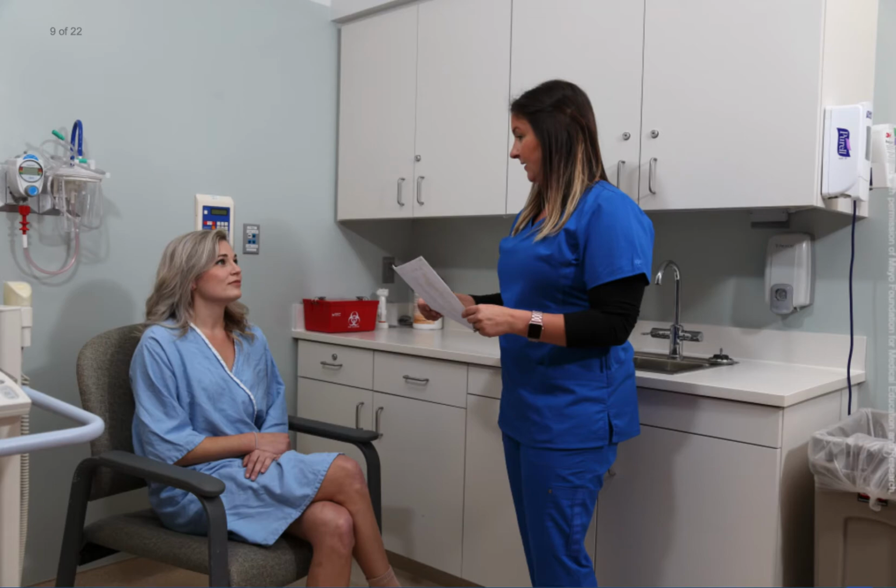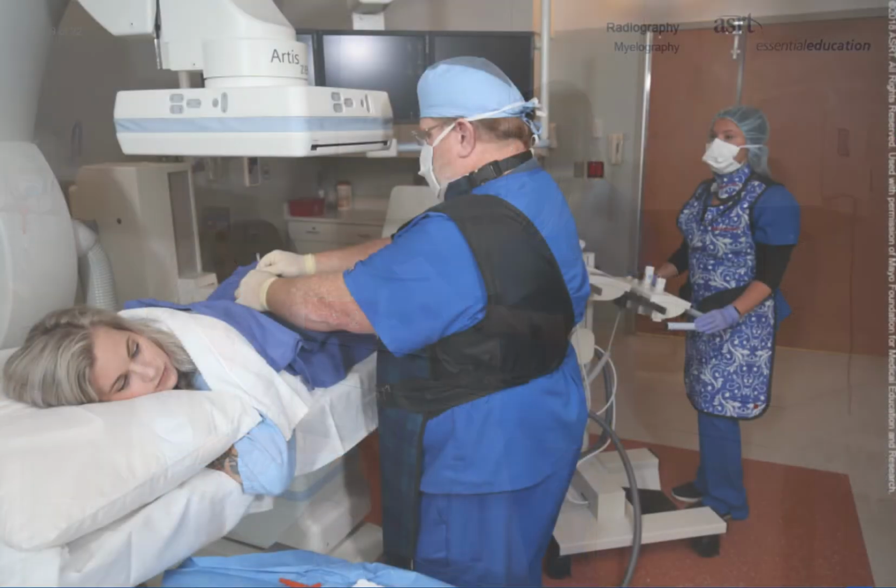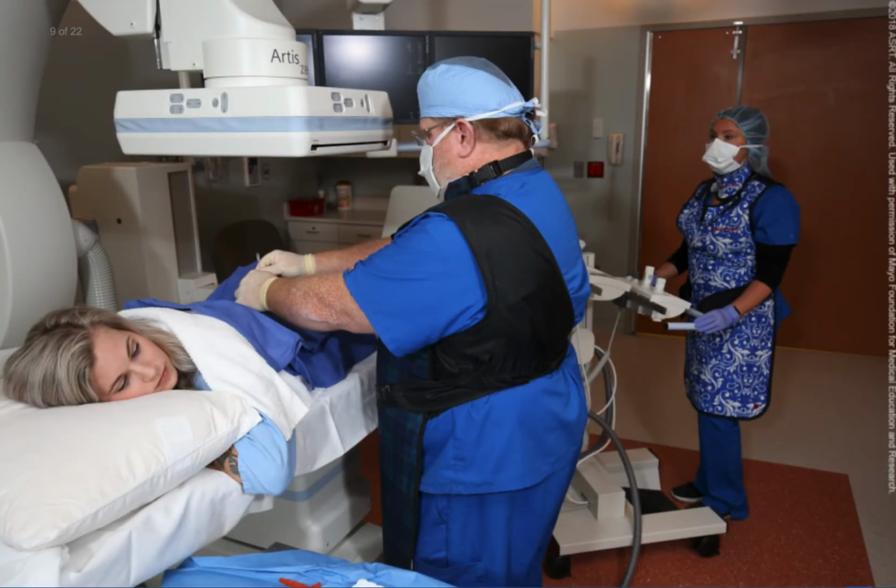The myelogram procedure is tailored to the individual patient, determined by their clinical condition and history. The procedure should be explained to the patient in advance to ensure maximum patient cooperation with instructions. Needle placement and any observed abnormalities should be documented and recorded with spot films or with last image hold.